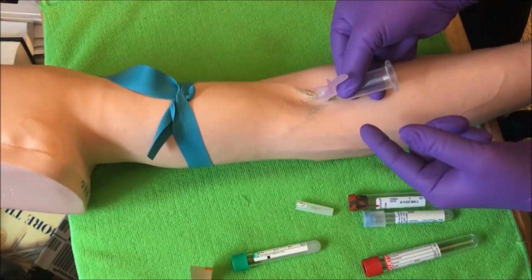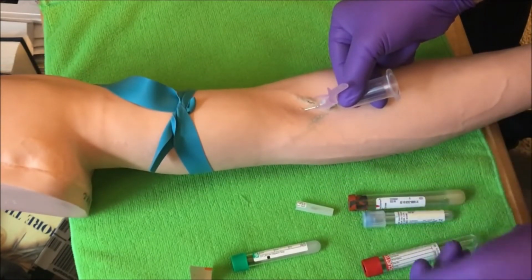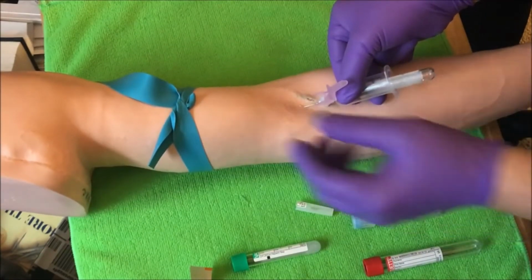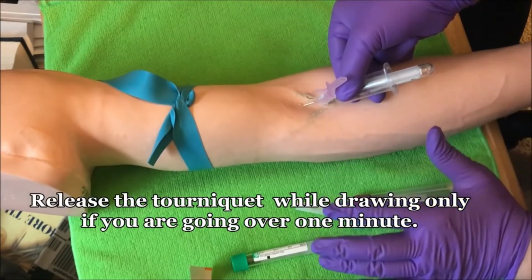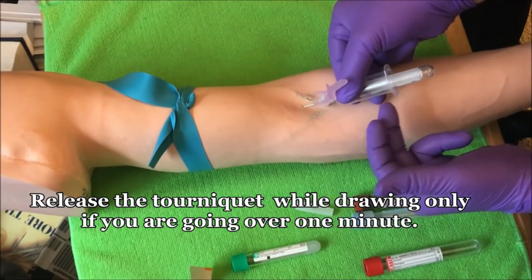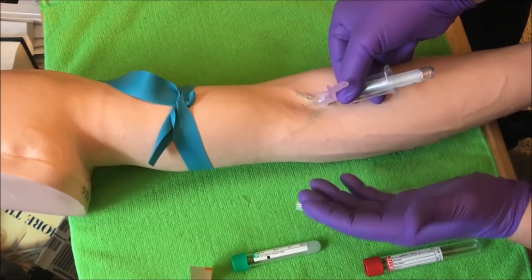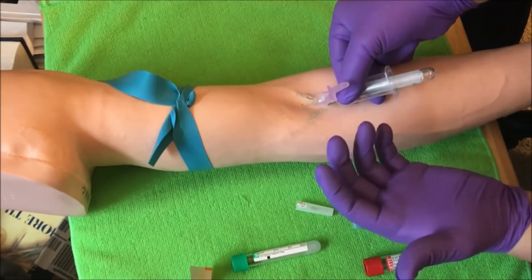Once I'm done filling up all my tubes, and I'm not at the 1 minute mark, then I'm going to release my tourniquet. Now some people like to release it while they're doing a blood draw. So if my last tube is my lavender and it's getting blood flow, some people like to release the tourniquet prematurely while it's filling up. The problem I have with that is that if this tourniquet is helping venous restriction and it's helping me get blood in, the minute I release that tourniquet, I could cause the blood flow to stop. It is a possibility. If you're in the vein well and it's getting good blood flow, it might not happen.